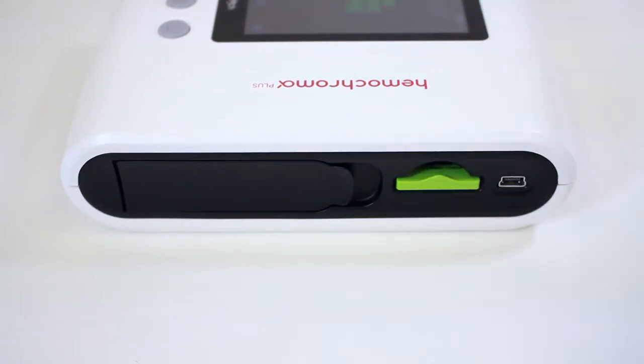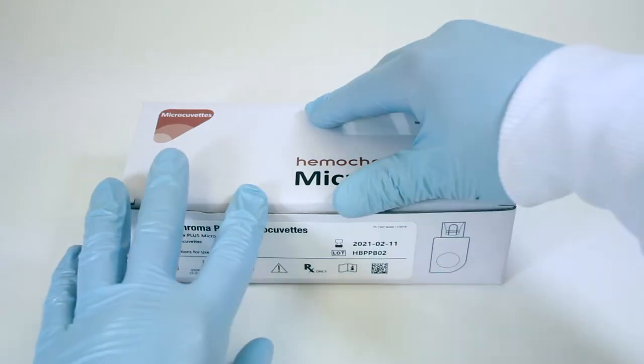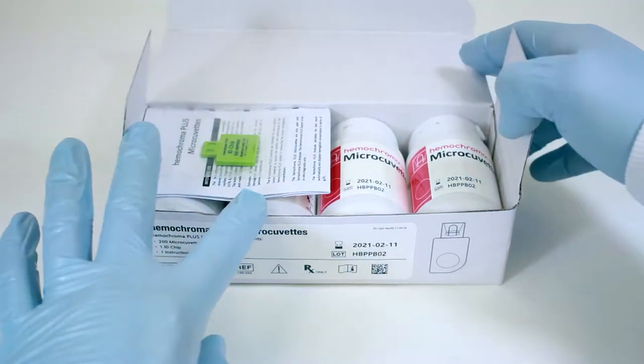Running a Test. Insert the ID chip in the ID chip slot of the analyzer. The ID chip is provided in the microcubit box.